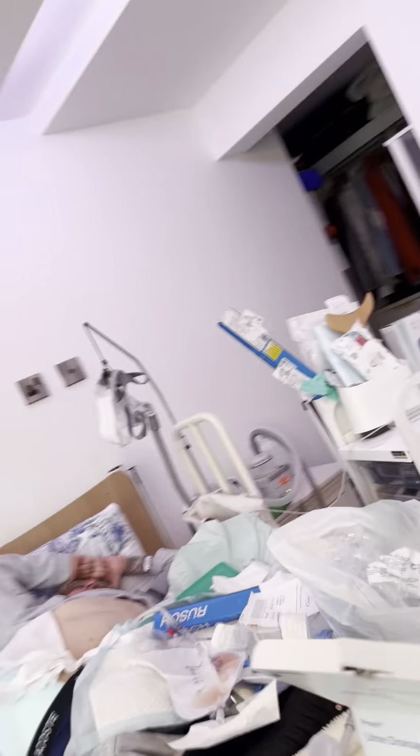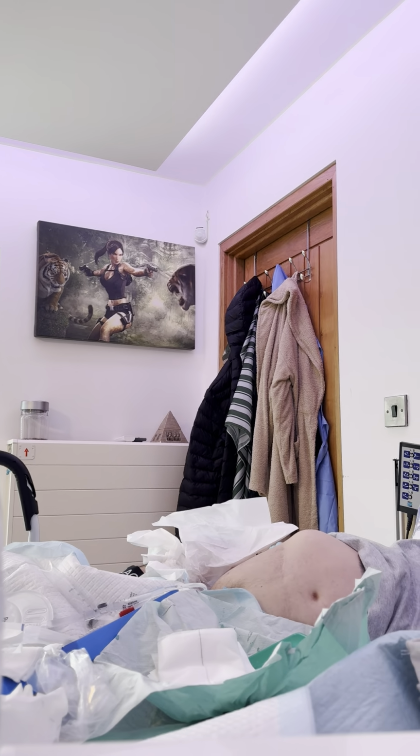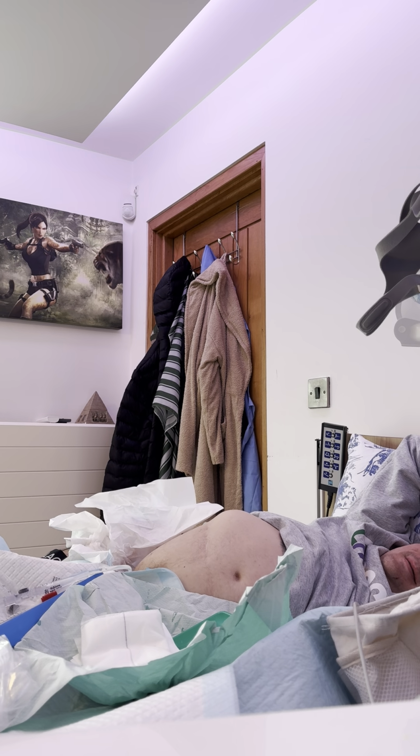Now I'm going to show you the balloon. Right, it's coming down now. Once he gets to about 120, 130, I will get Ben up. It will be perfect. So I'm going to show you this. Are you blowing it up there? So interesting, because I've never seen this.